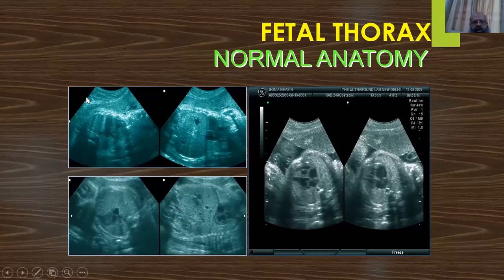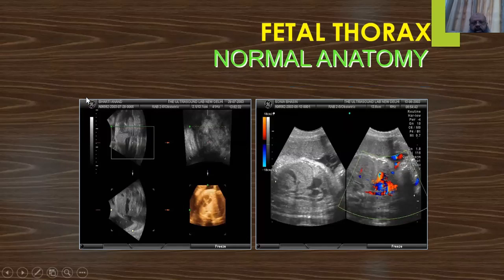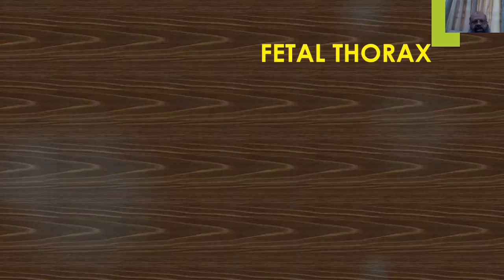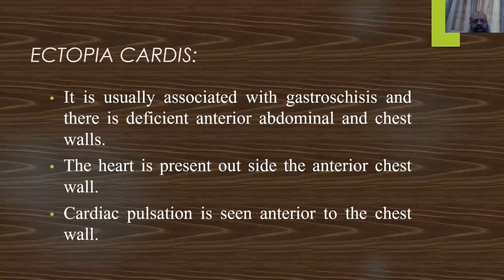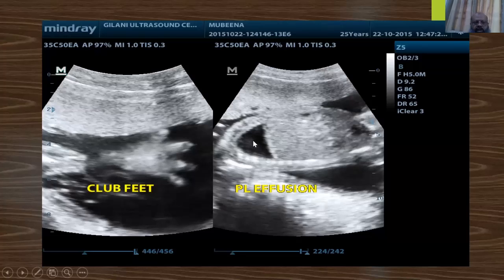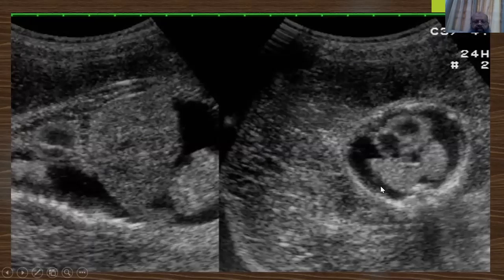In the thorax, we can have some abnormalities. Let us discuss the main thoracic abnormalities. Like we can have fluid, which is the pleural effusion. This is pleural effusion. Here we have the pleural effusion with pericardial effusion. This is sagittal view and cut section.